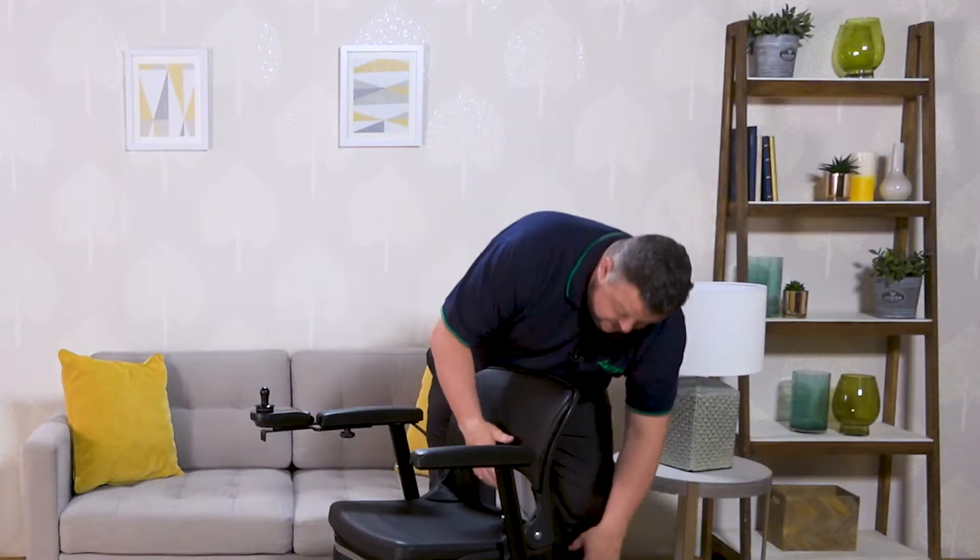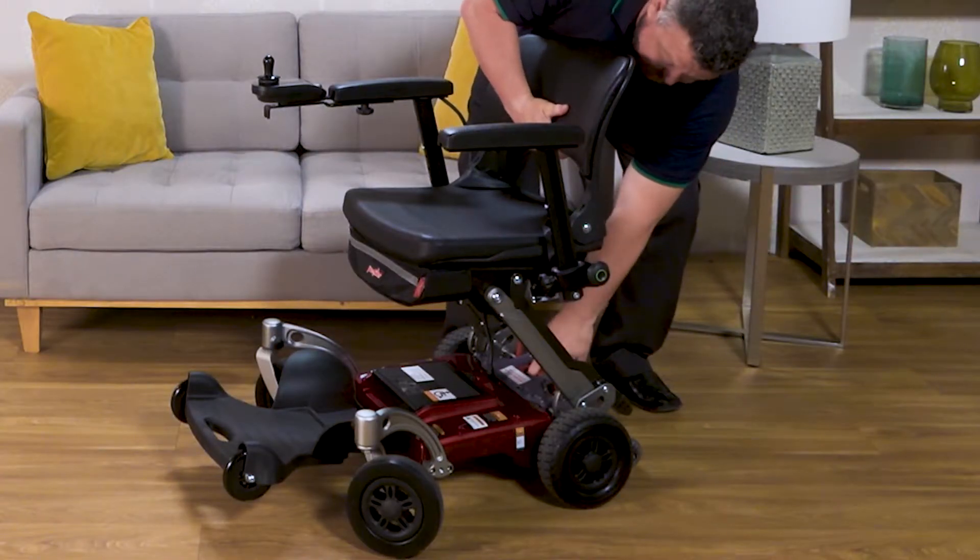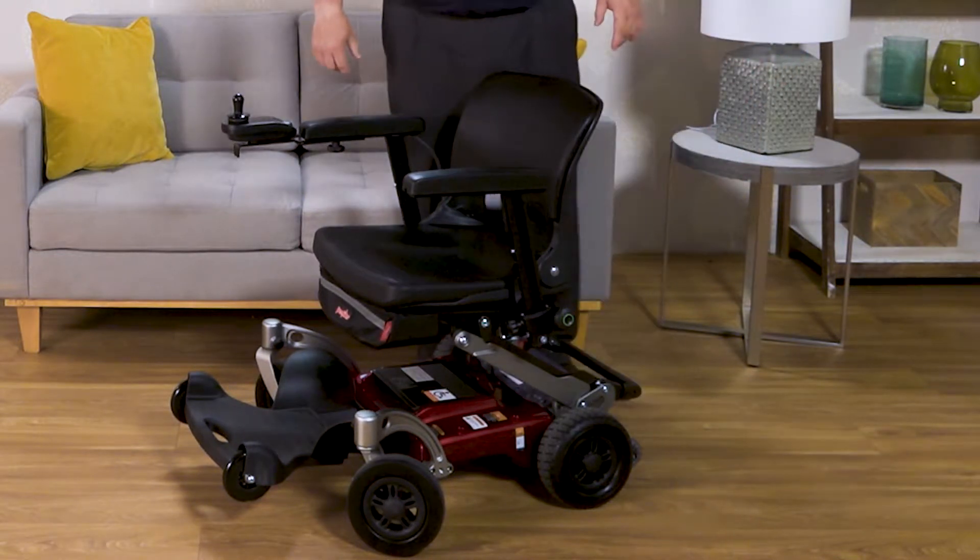The seat has two height adjustments. We're currently on the higher seat adjustment, and we can lower it down to the second adjustment like so.